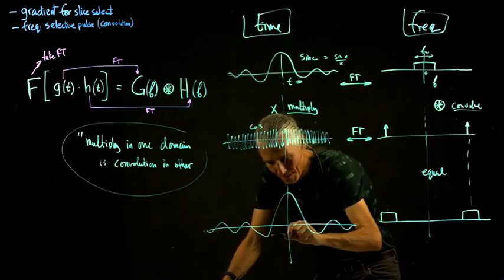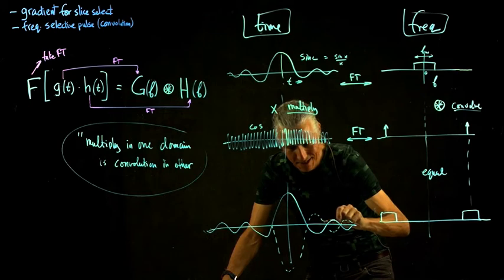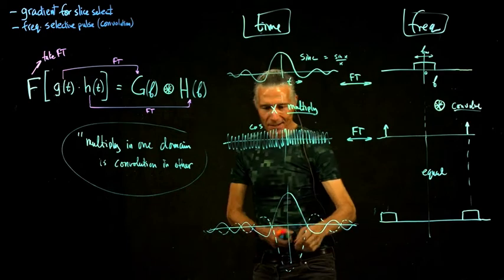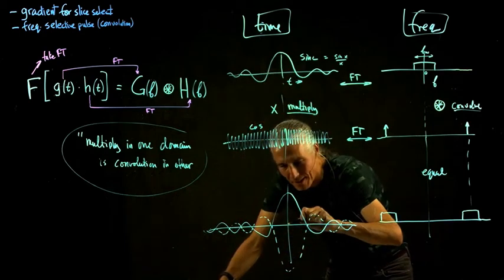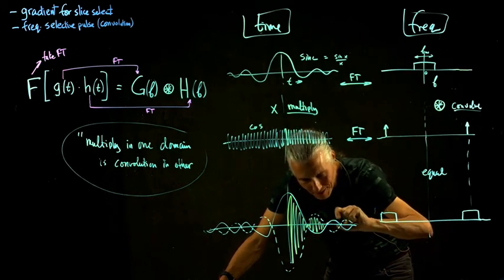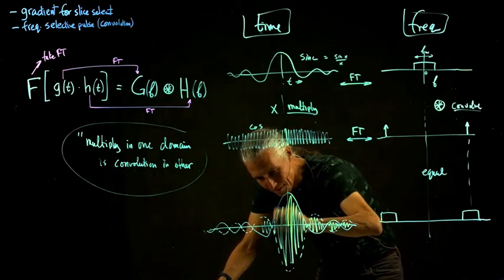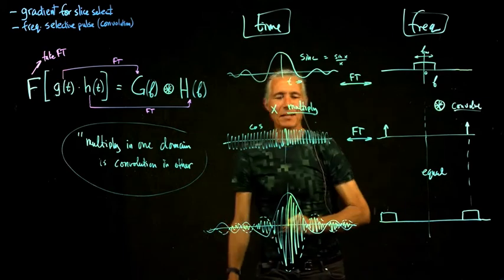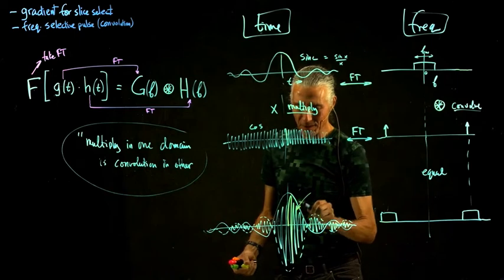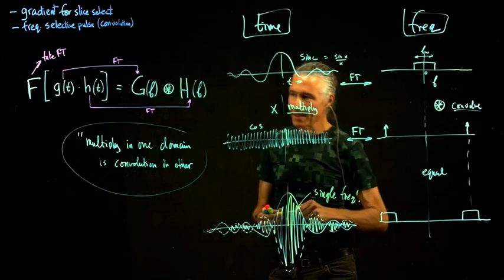And so, what does that look like? It looks like a little weird modulated cosine. Like this. So what does it look like? Starting here, you got a big sine, and it goes up and down like that, and then it goes small, and then it goes big again, and then it goes small, and it goes a little bit less, and a little bit less. So amazingly, it's got a single frequency in it.